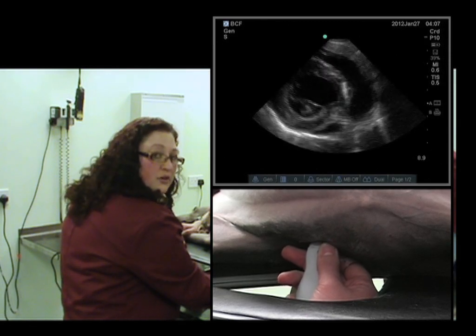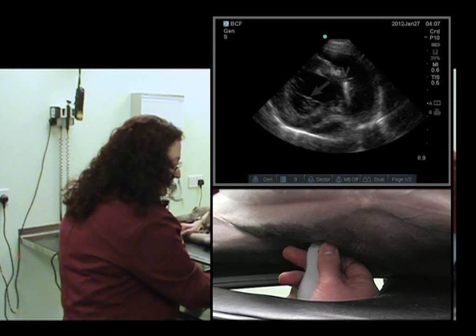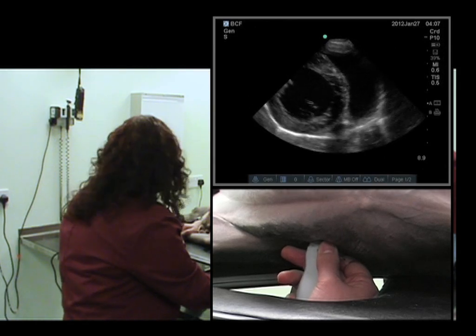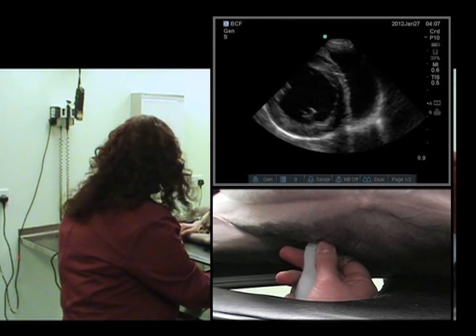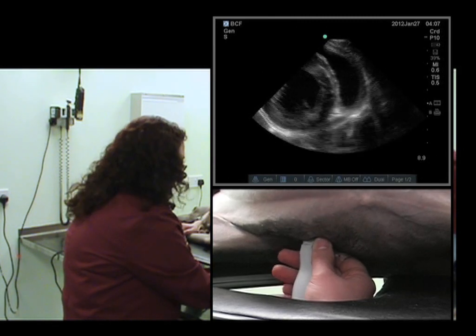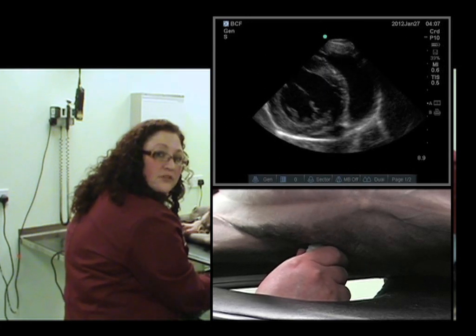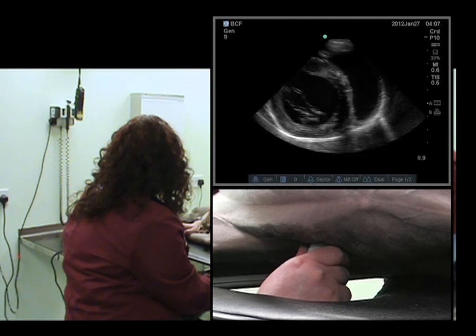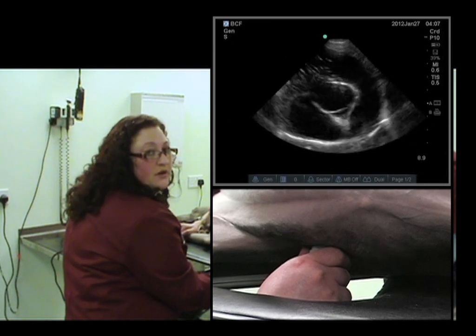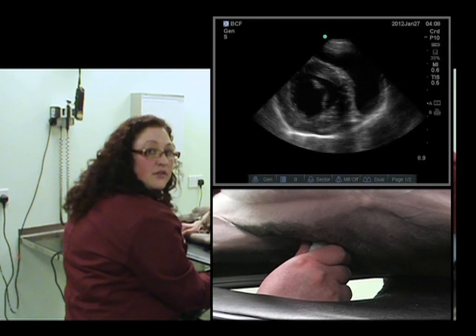The fish mouth is starting to come into view. If this is an uncomfortable position for your hand to maintain this level of rotation, a trick is to grasp the probe with your left hand, maintaining this rotation, and re-grasp it. However, this does mean your thumb will no longer be on the marker, so it's important to be aware of that. It does allow you a little bit more comfort while performing your scan, which is very important. And that's the level of the fish mouth.